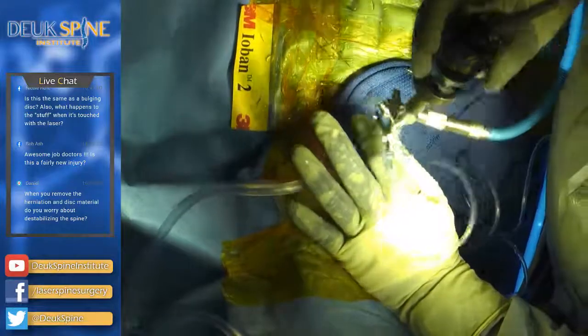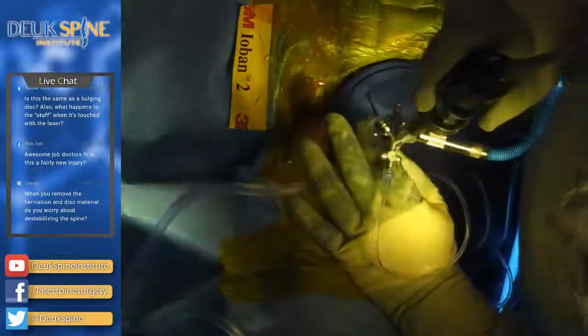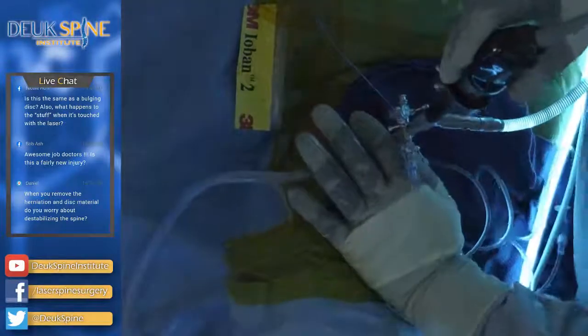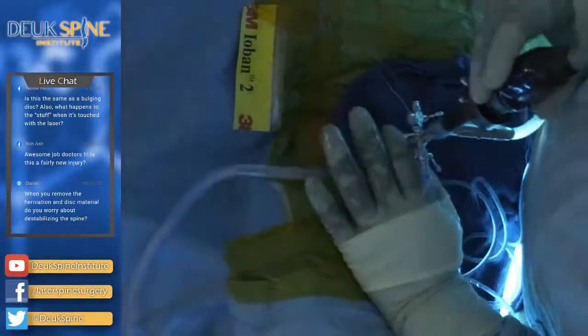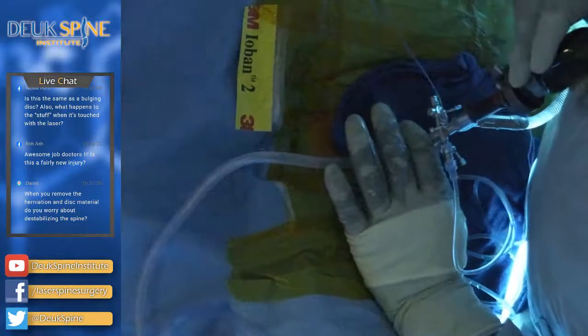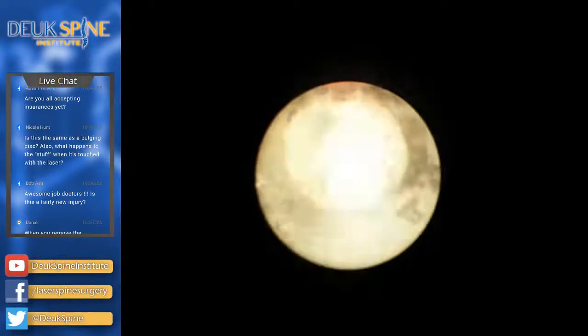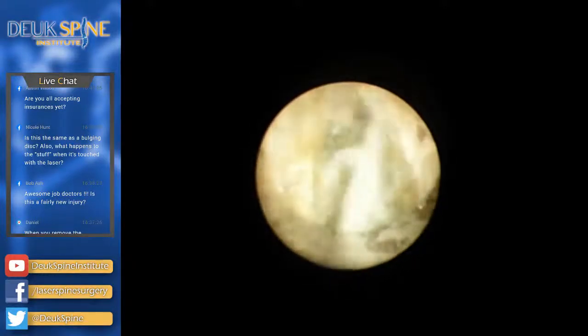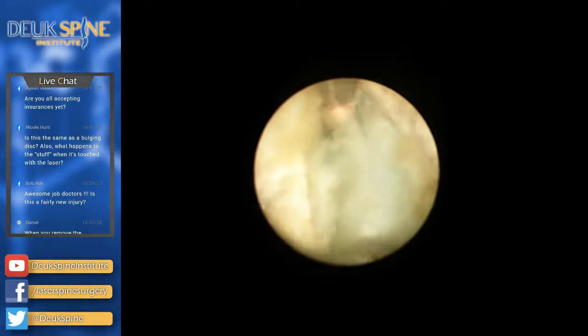All right, that is a little better. Yeah, that's better. I usually do it using the scope. Hey, where's my laser? I usually do the white balance using the scope directly. Yeah, that's good. We have a couple more questions.